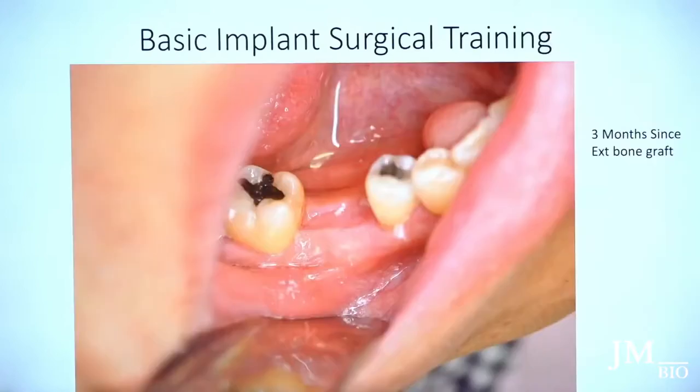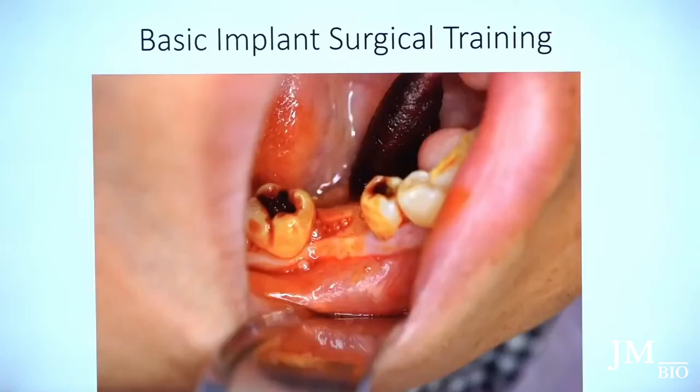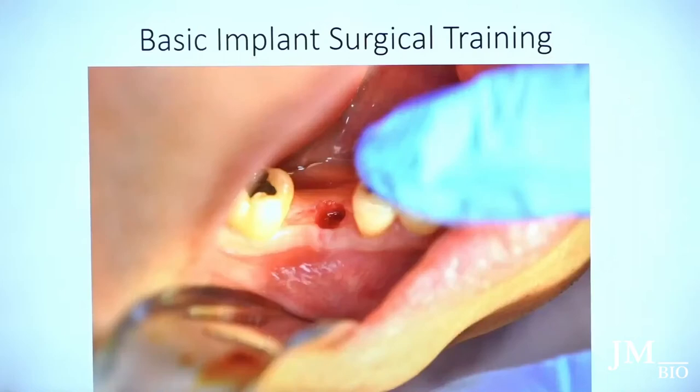The patient has a wide ridge and plenty of keratinized tissue. In these types of cases I like to be atraumatic — I just did a punch. This is betadine; I get the patient numb and scrub the site with betadine routinely for most cases, unless they're allergic to iodine or shellfish. Then I create a punch, perfectly sized, remove the core tissue, and start my osteotomy.